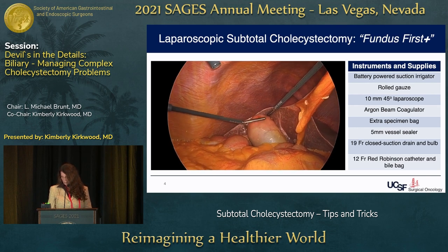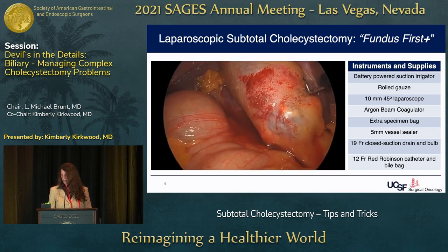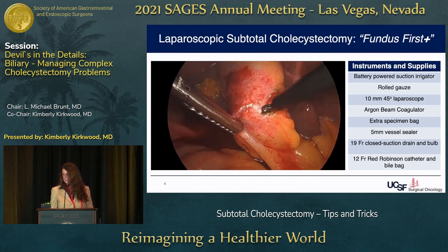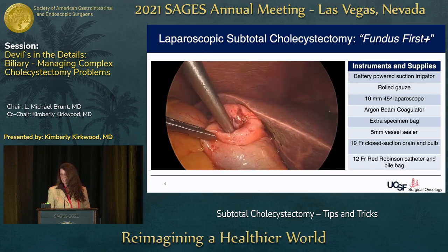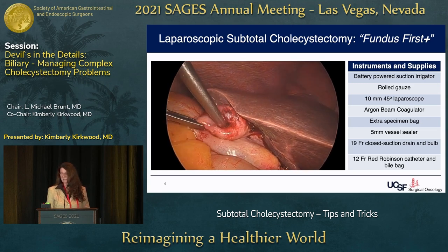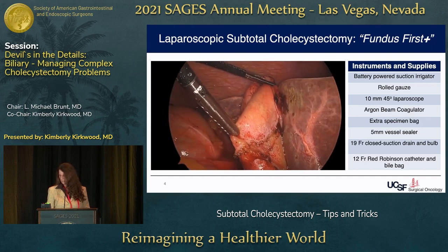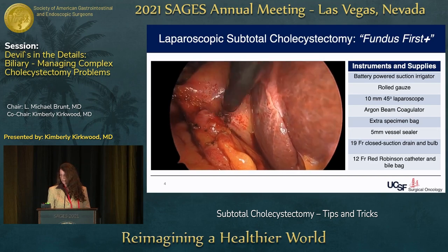It's not a good sign when your assistant spends 15 minutes trying to grab the fundus and you have to use the old-fashioned toothed grasper. The gallbladder was very thickened and indurated. I started dissection over Kalos node to get a clue as to where the cystic artery is, then used a harpoon to try to decompress it. I had only a small hope this would improve dissection, but sometimes it helps. Attempts at developing an optimal dissection plane by blunt dissection turned out to be pretty much futile.